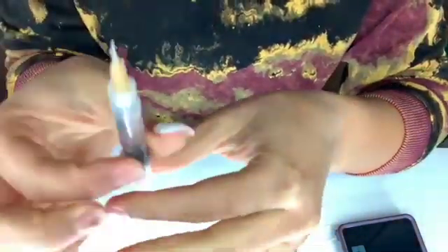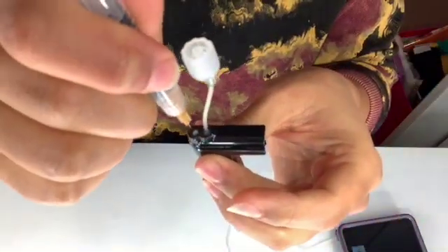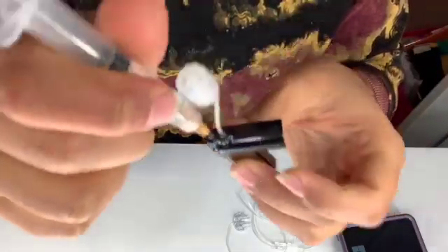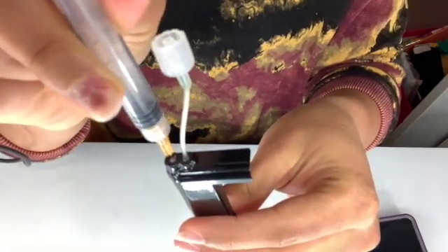I like to hit it with either my finger or a pen just to make sure all the air bubbles are out. And once all the air bubbles are out, you're going to put it back into that little hole. And now we're going to push all the insulin into the cartridge.